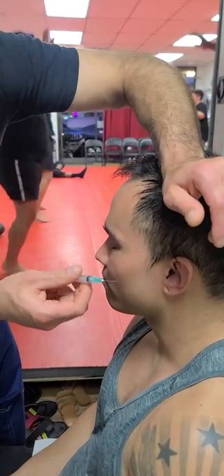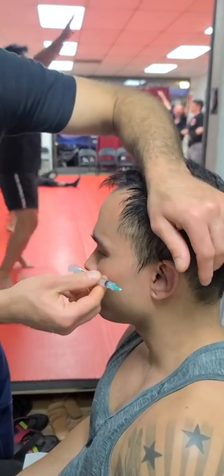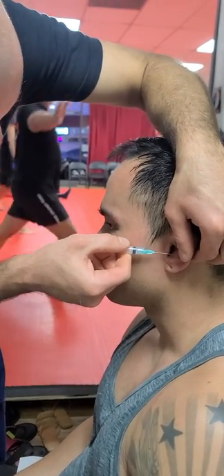Take a couple deep breaths in, deep breath in, let it out, and you're going to bevel up. Deep breath in, let it out, one more deep breath in, let it out.